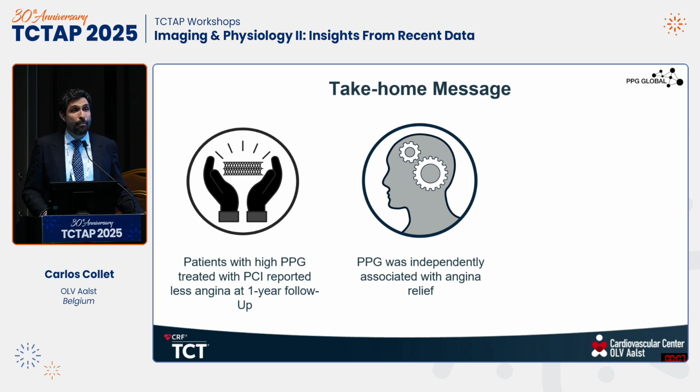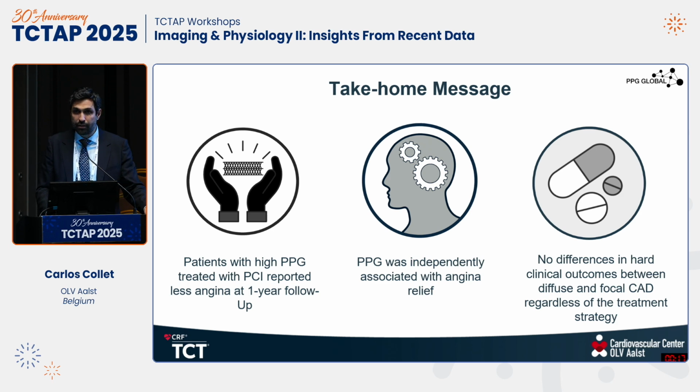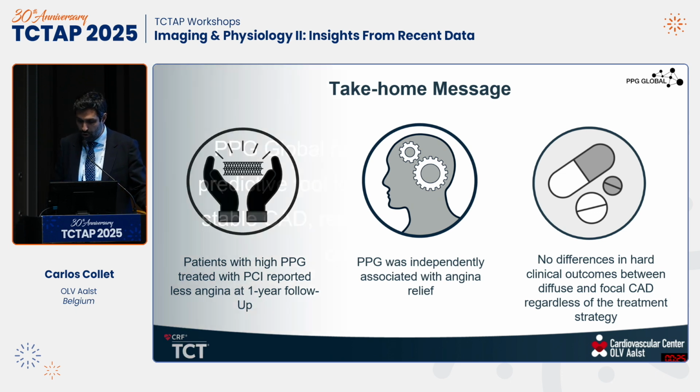PPG was independently associated with angina relief, and it was independent of other clinical factors, including FFR, so it provides additional information to FFR. And I think it's also interesting, hypothesis generating, that we did not see any difference in endpoints between the different treatment modalities.